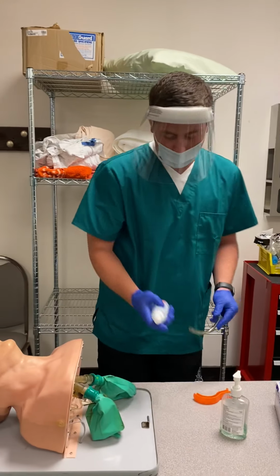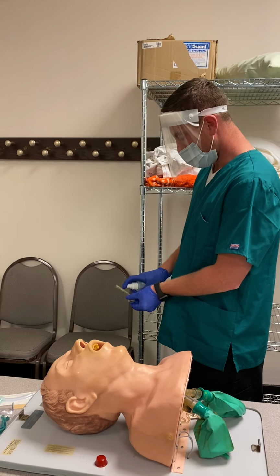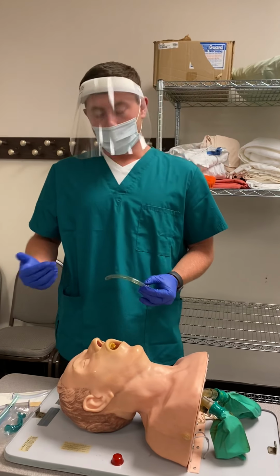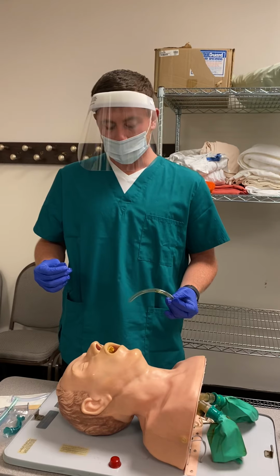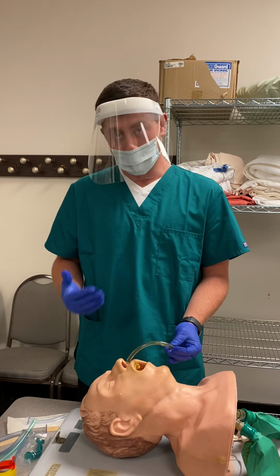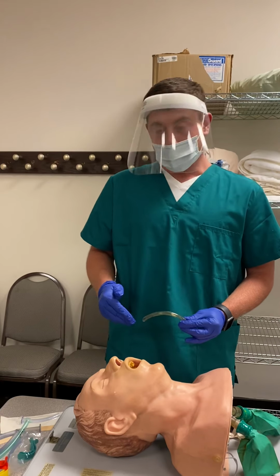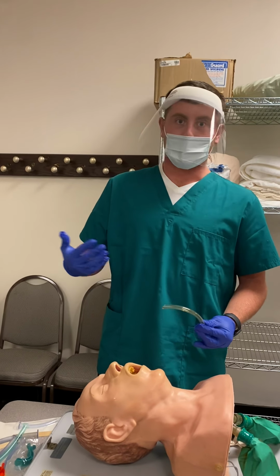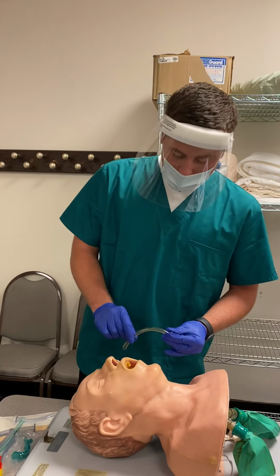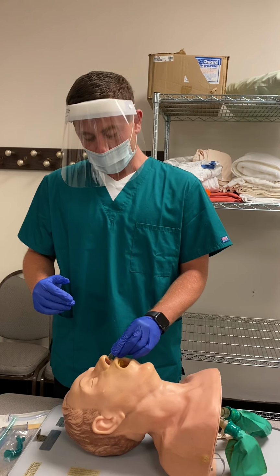Before putting it in, you will use lubricant to allow the tube to slide easier through the nose. When inserting it, you're going to want to use gentle but firm pressure to allow an easier way to insert it into the nose. And then you are going to want to look at the nares to decide which one is bigger, and you choose the bigger one first to insert it because it will be easier to get through as you're inserting it. If you run into any trouble, give it a slight twist.